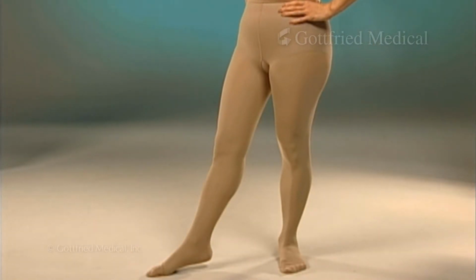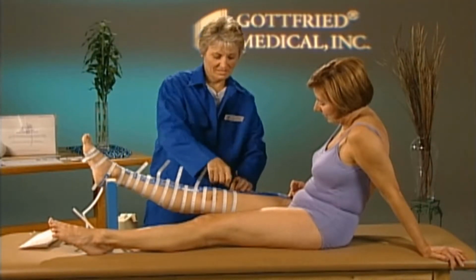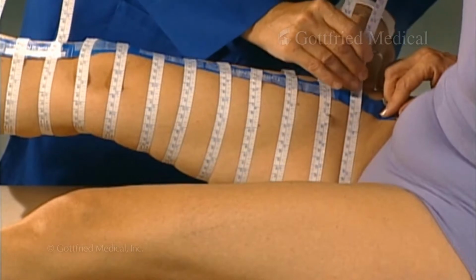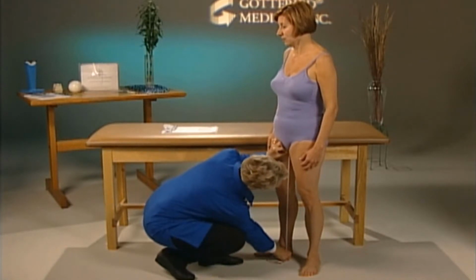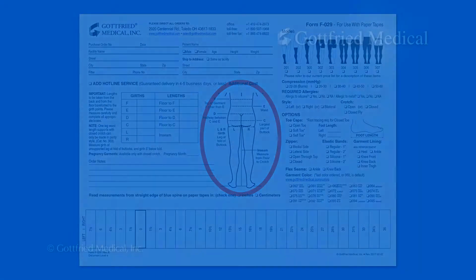Measuring for a waist length support is similar to thigh length, except that it requires a few additional measurements. Start by measuring the leg as you would for a thigh length garment. However, instead of stopping 2 inches below the groin, extend the measurements as close to the groin as possible. Next, measure for girth and length using a sanitized cloth or disposable measuring tape. A diagram on the form shows where to position the tape.